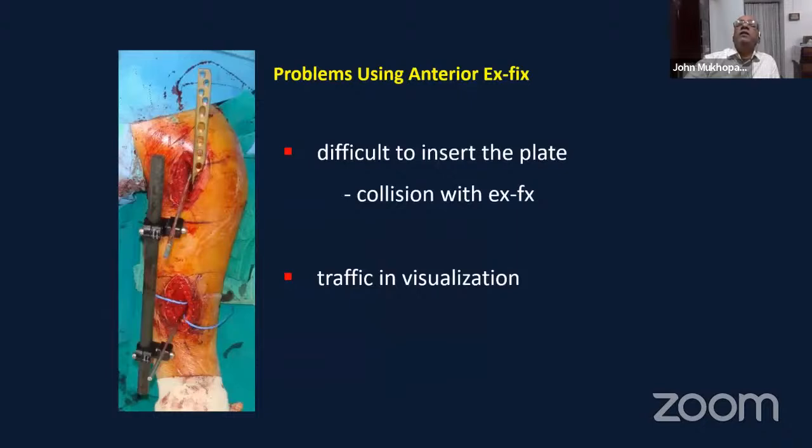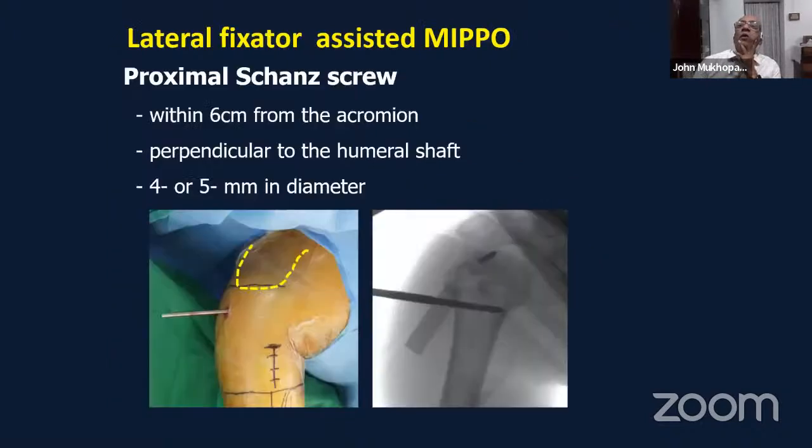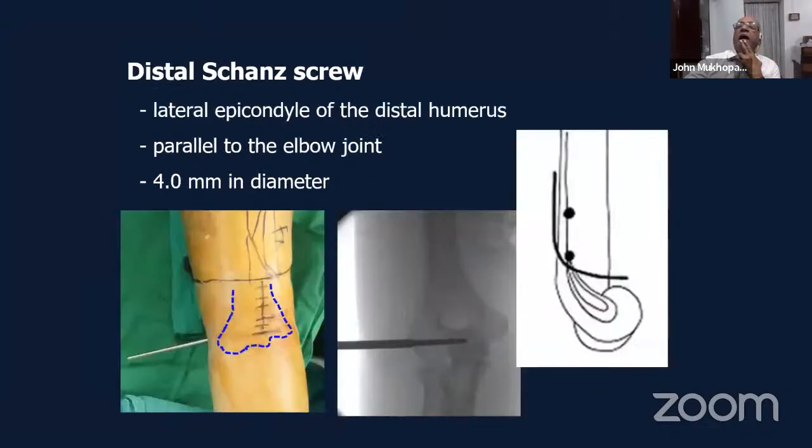So there are some problems with using the anterior fixator because you can have difficulty in visualization. Another way would be to use multiple pins, but there you risk nerve injury and it takes a longer time to perform and is not so easy to control. So one way of doing it is to just put two screws, one proximally, just proximal to where you would pass your plate from, which again, these are thick Shanz screws, and then put one distally at the lateral epicondyle level where you're safe from the radial nerve, and you go exactly transversely at these levels parallel to the joint.